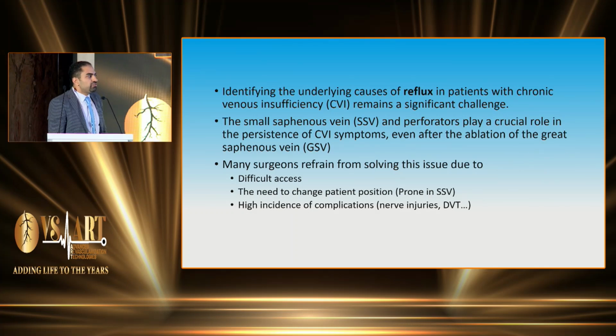But many surgeons refrain from solving this issue due to the difficult access to the small saphenous vein, the need to change the patient position from supine to prone, and the high incidence of complications in the literature, such as nerve injuries and DVT.